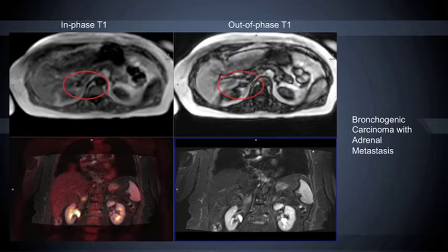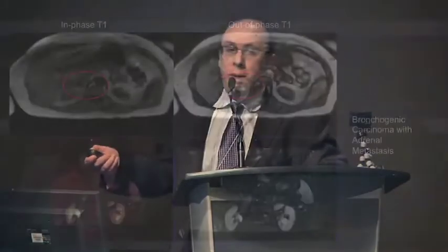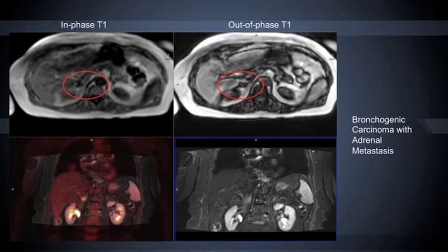And just as an interesting example, those that are familiar with MR, we can use the inherent signal characteristics of adrenal lesions on MR to help decide whether we're dealing with a benign lesion like an adrenal adenoma, or is this truly a metastasis. One of those clues on MR is between the in-phase and out-of-phase T1. It's a known fact that benign adrenal lesions tend to have some fat, so we expect to see a signal drop-off on the out-of-phase image. But in this case, difficult to see here, the signal's increasing on the out-of-phase. It's concordant with what we're seeing on MR, metastasis.